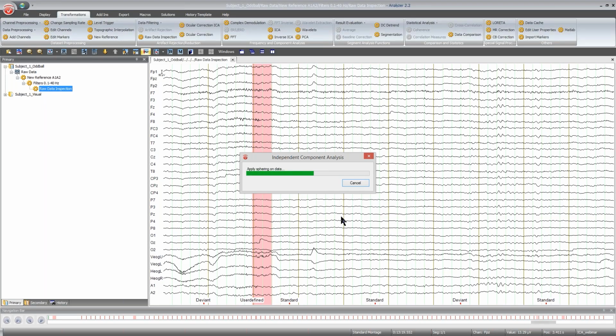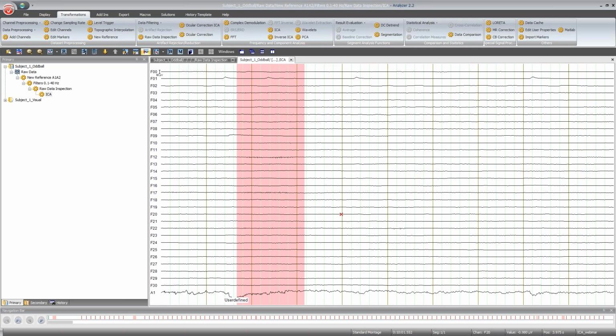So there we go. You have to keep a couple of thoughts in mind. Of course, the faster the computer is, the faster it might run. The more data you put in, the slower it might run. That goes for the number of channels you put in, but also for the number of data points that you put in, sorry.